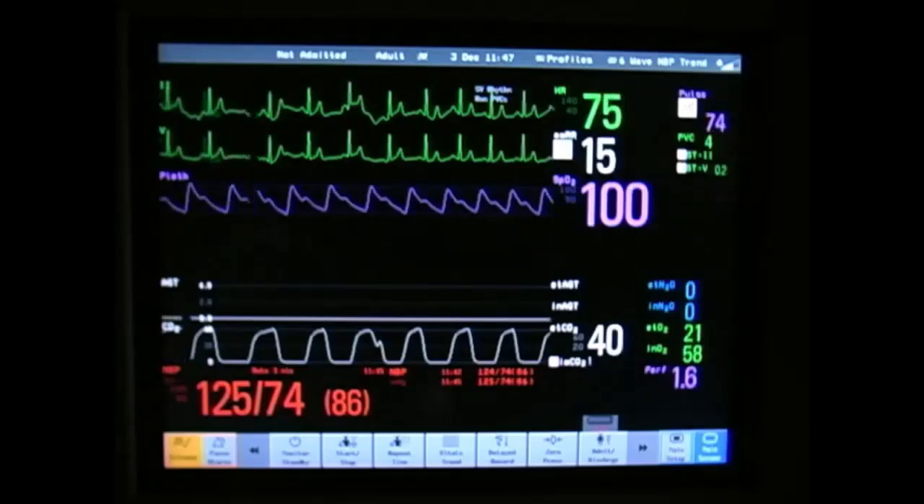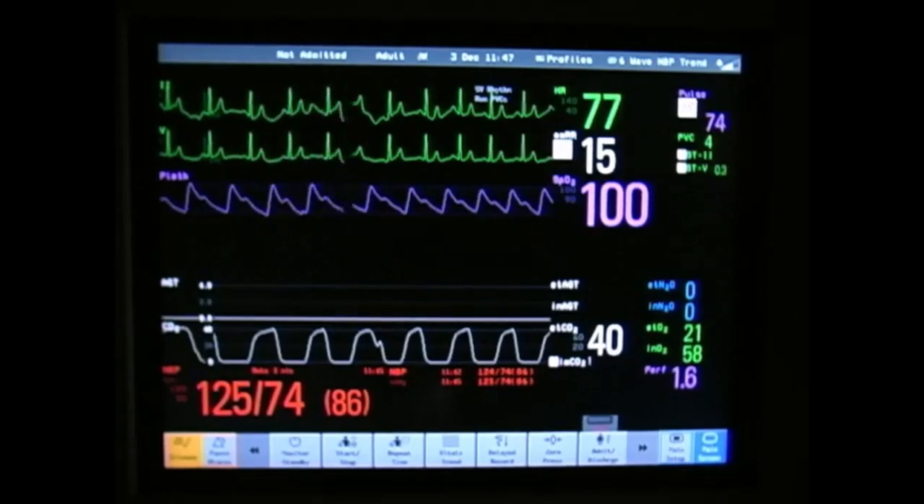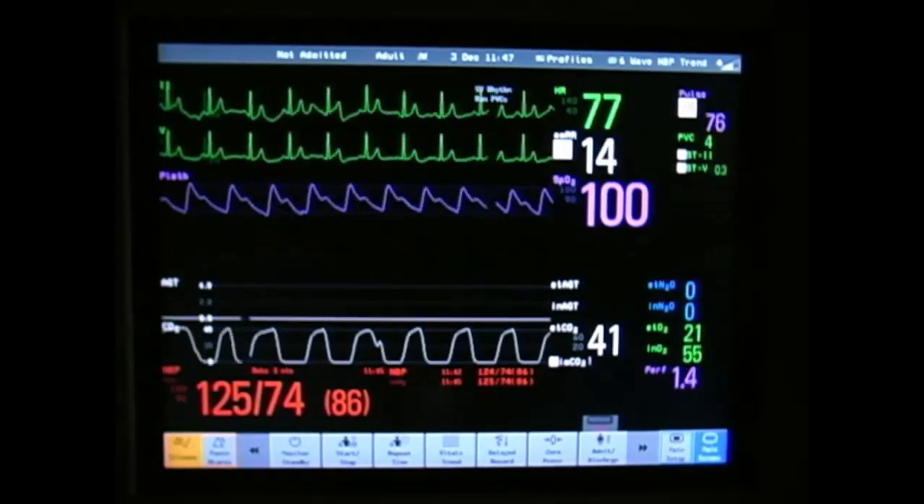During the anesthetic injection, monitor the patient's vital signs for evidence of systemic toxicity, including a notable change in heart rate.